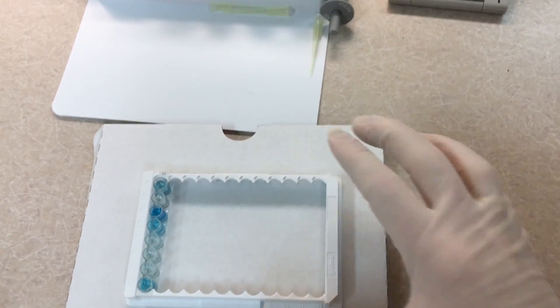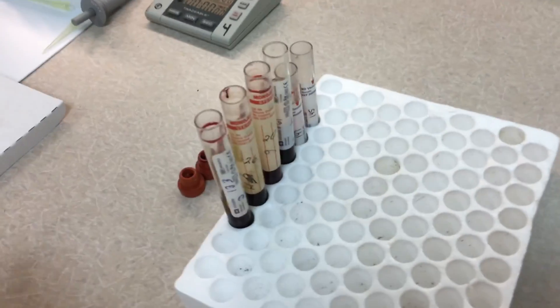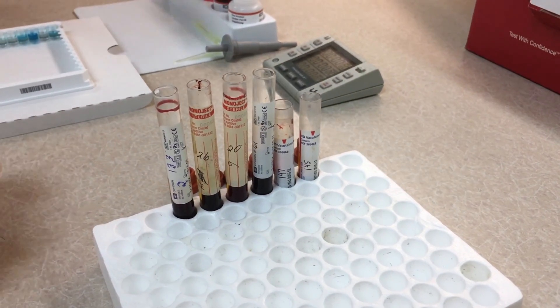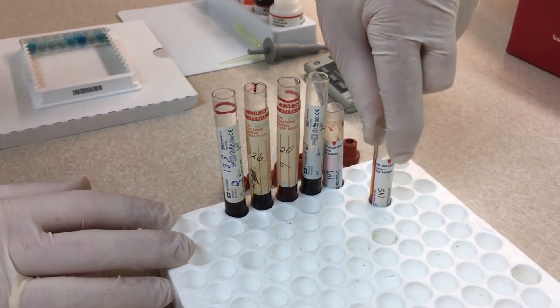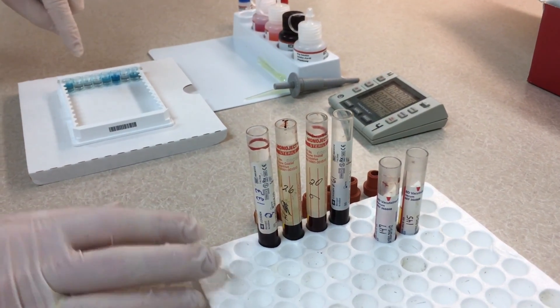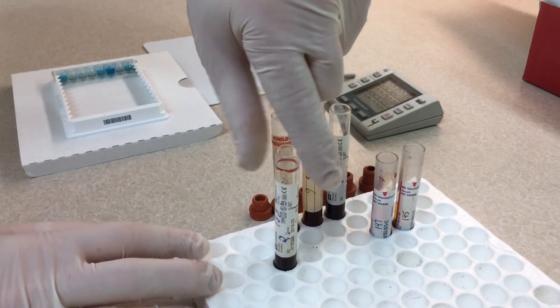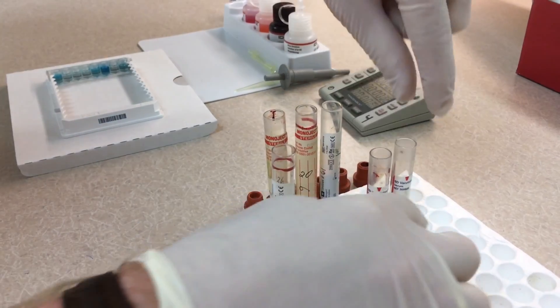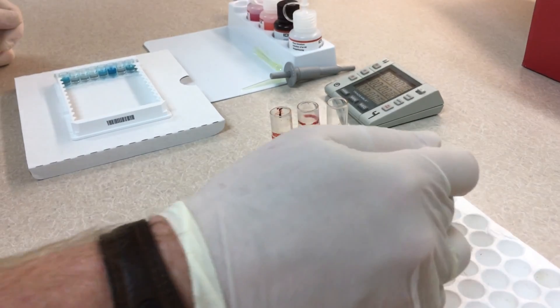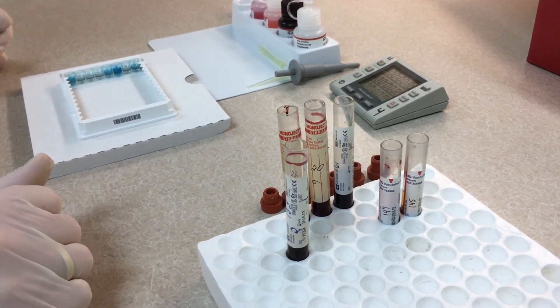Once you have your results, bring your samples back over. Since we had them lined up, we know what's what — positive and negative controls at the top, and then our first sample which was blue, so that's a pregnant. Another blue one, that's pregnant. Three clear ones, those are open. And the last one is blue, so that's pregnant. So we have three pregnant and three open.